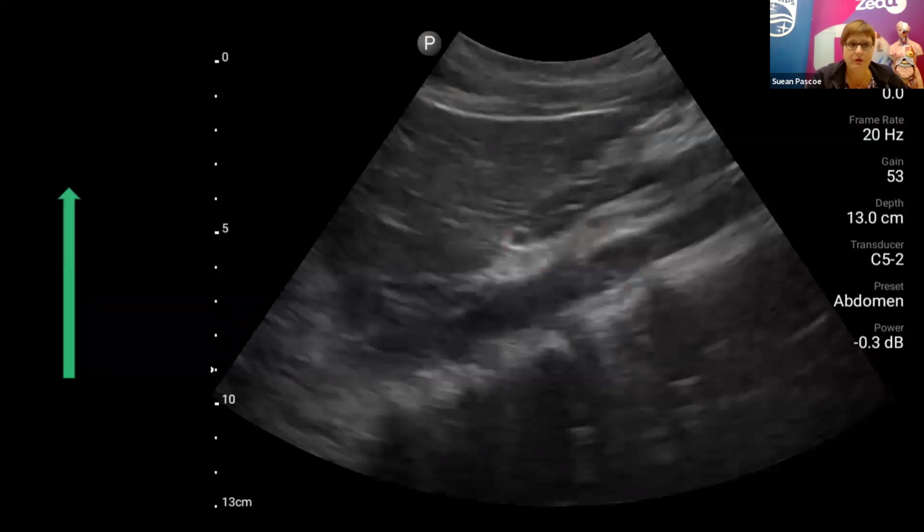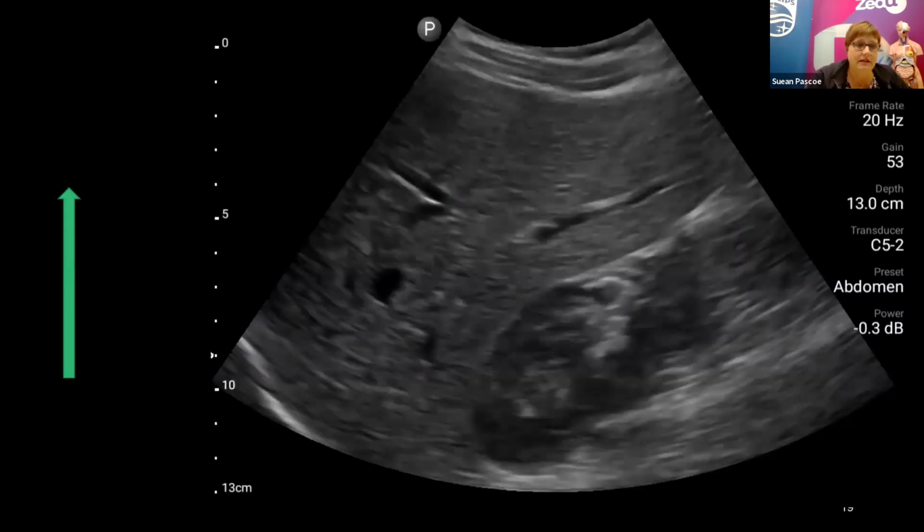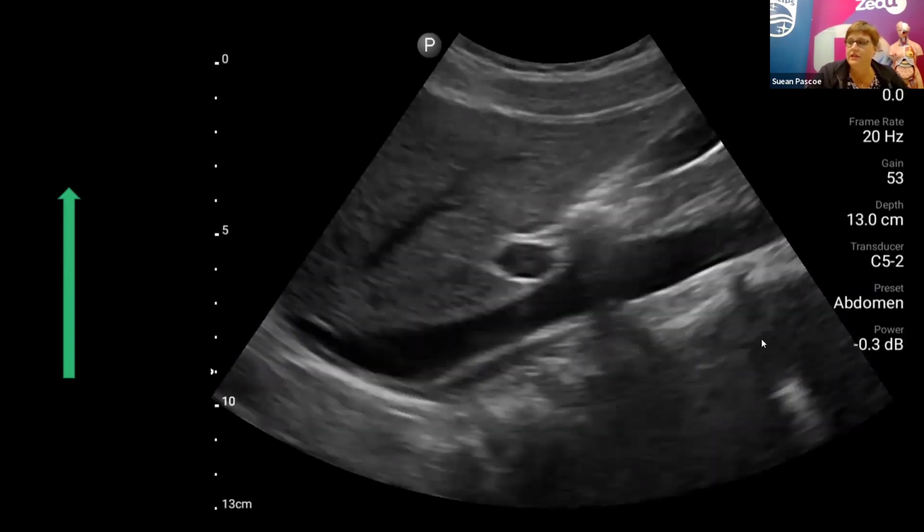So starting from midline, let's look at what those pictures look like. When I'm in the midline, we've got aorta. I have my probe marker pointing to the patient's head. And I follow the costal margin laterally until I see IVC. If I get to kidney, I've gone too far. We're now into the substance of the liver. So then I need to come back towards the midline until I see where the portal vein here is just entering the liver. And you can see just at this point, the bile duct sitting over the top.